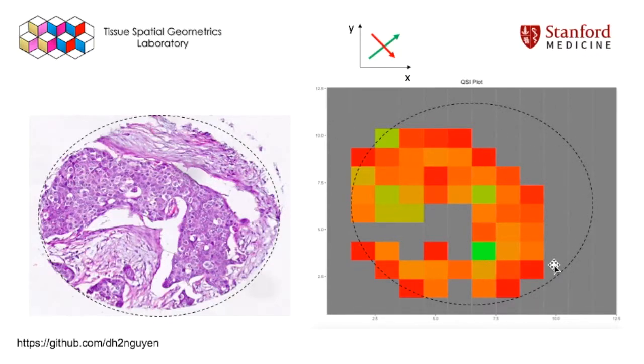So we can see from here that there's a lot of spatial information that can be extracted from an image, and that things like borders are very important, because we know from studies that the extracellular matrix at the border of a tumor is much stiffer than it is inside that tumor. And that stiffness dramatically changes the biological properties of the cells in that region. Thus, the quadrant slope index method can extract really useful information from routine images that are just too complicated for the human eye to assess.